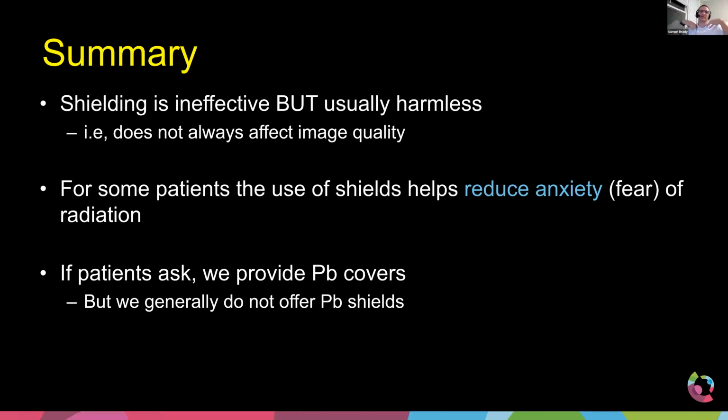You saw that one image of a breast shield where they actually had it come over the chest, and it just covered the 2 locations of the breast, where there was another one that laid strapped across. So they all come in different shapes and sizes. There's really no difference in what it's doing.